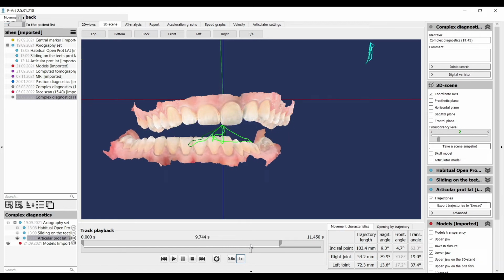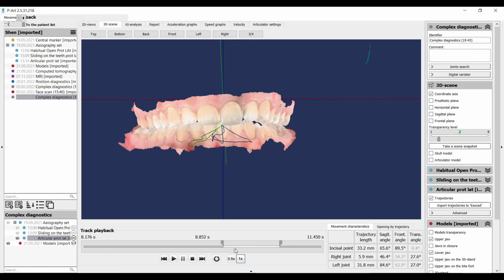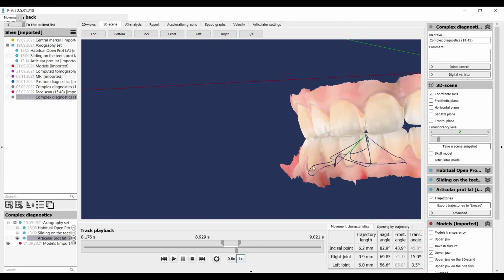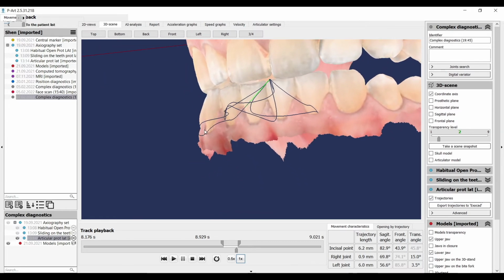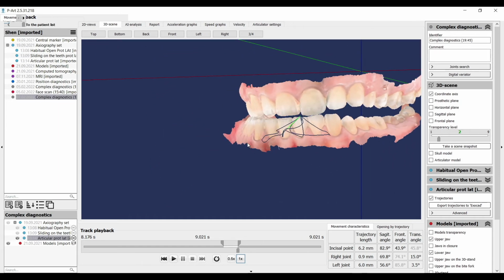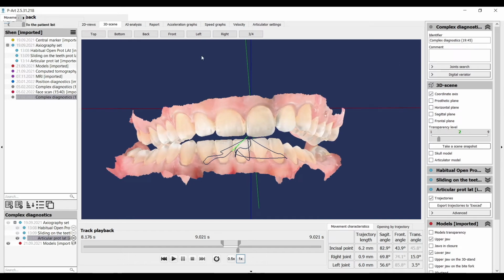How is it calculated? Now you have a protrusion trajectory, then move it to habitual bite. The first part of the trajectory we limit with the slider. And check lateral protrusion movement, for example right movement. Also, the canines should be edge to edge. Now you limit the trajectory with the slider from the other side. When you analyze lateral protrusion you have a working side and a balancing side. You set the articulator according to the balancing side. If you have right laterotrusion, you calculate the left trajectory.